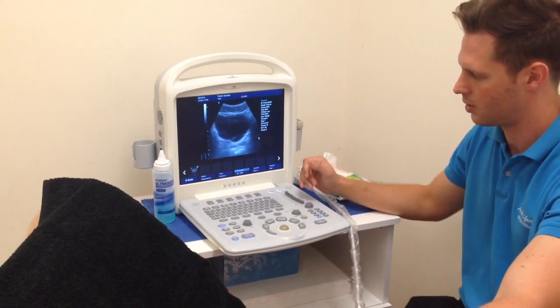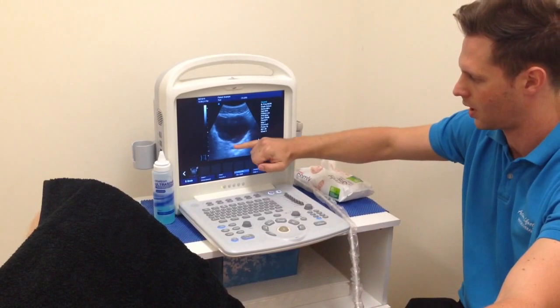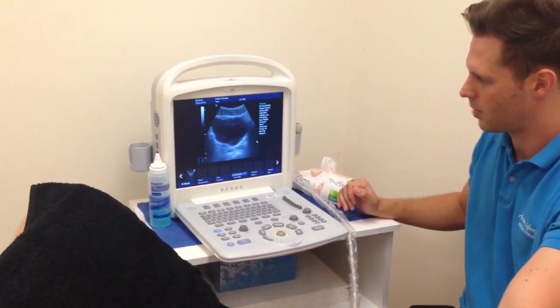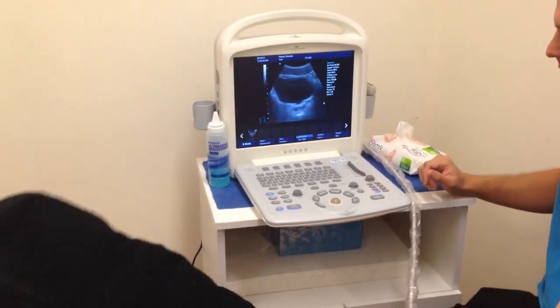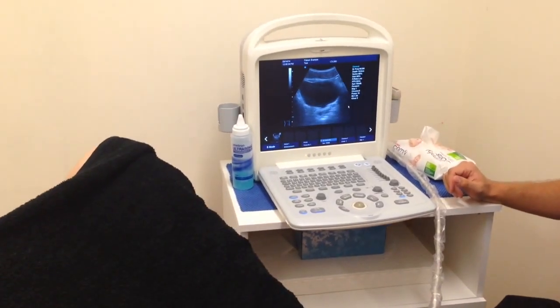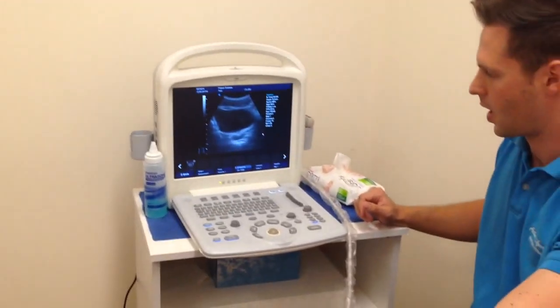By contracting the pelvic floor muscles, what we should see is that inferior posterior wall of the bladder rise up a little bit on the screen. Ben, I'll get you to start with a straight leg raise — just bring the leg straight out for me. And back up. One more time. And back.